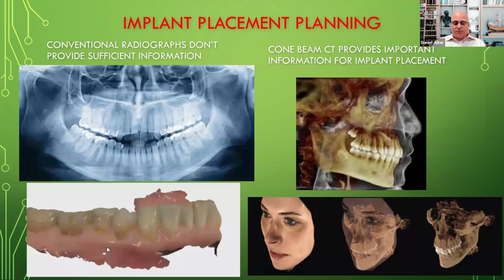But it also allows for a greater patient acceptance when they're seeing the end result in their mouths and they're speaking and they're being very fluid. It just resonates emotionally with them rather than seeing a model, for example. Oftentimes we do a diagnostic wax up, they look at the model, but it doesn't always translate to what it would look like on them or in their face.